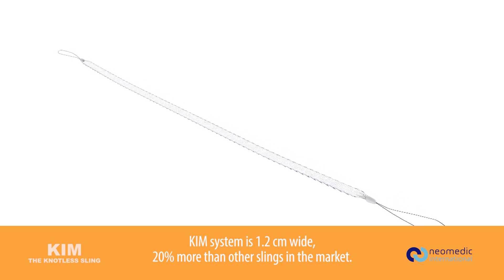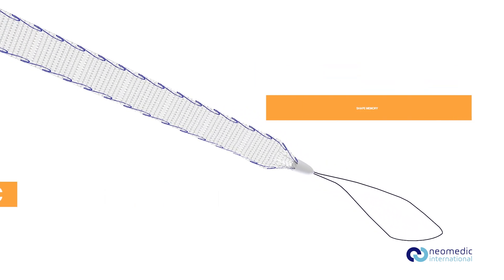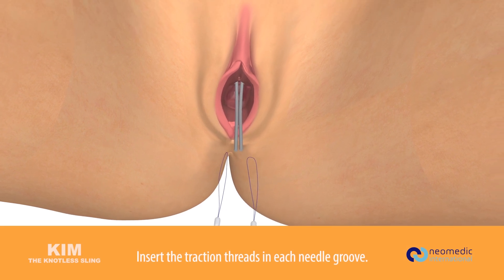The Kim system is 1.2 centimeters wide — 20 percent more than other slings on the market. It features a macro-rigid, micro-elastic, shape memory design. Insert the traction threads in each needle groove.